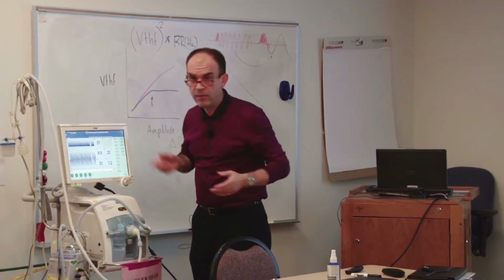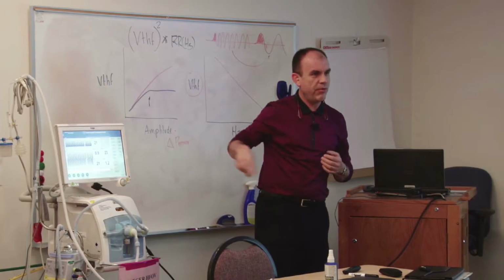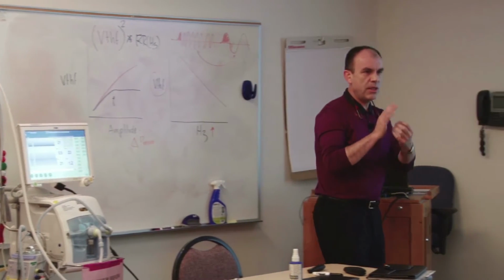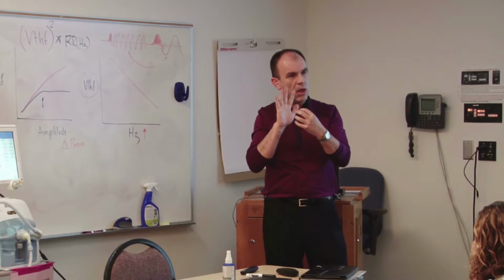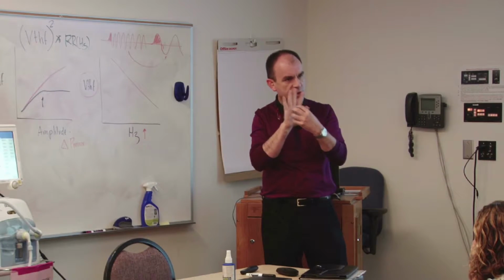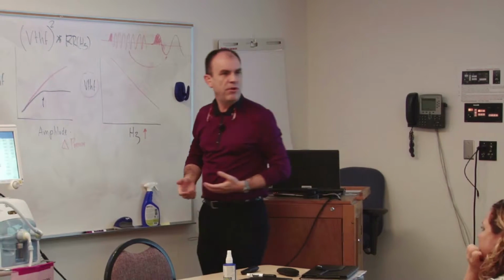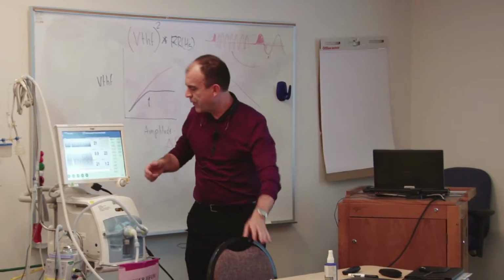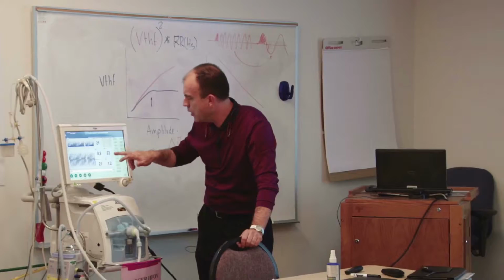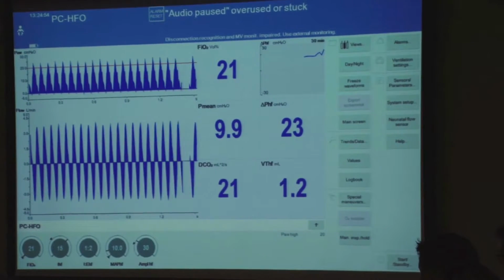And this ventilator has much less power at higher frequencies than the SensorMedics. Is that because your diaphragm is so much smaller? Yes. Once we turn it off, I can show you the diaphragm, because it has a mixed mechanism. It's a flow interrupter, but also a tiny oscillator. You've seen the respiratory valve. We can disassemble it later. It's very easy. And so we'll pump it up to 30 and see what happens.